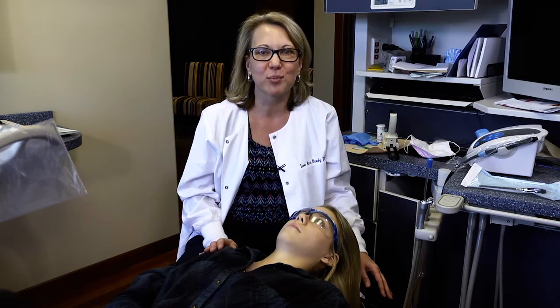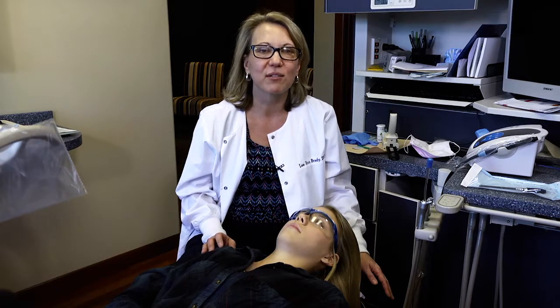If I was using the QuickSplint as an intra-procedure management strategy, I might make that QuickSplint for Jenna, and in addition to making sure we had adequate time during the procedure to give Jenna time to stop, close her mouth and rest, not using a bite block, not cranking her mouth open to a point where we're going to exacerbate what she's experiencing from a standpoint of her joints or muscles, and going through the list of during procedure protocols that we're going to manage a moderate or high risk patient. During those rest points, we could have her actually rest on a QuickSplint because the device is actually designed to decrease the activity of the elevator muscles. When we decrease that muscle activity, we actually can decrease the load across the joint, and it's a great way for her to have those minutes of rest and maximize that time.